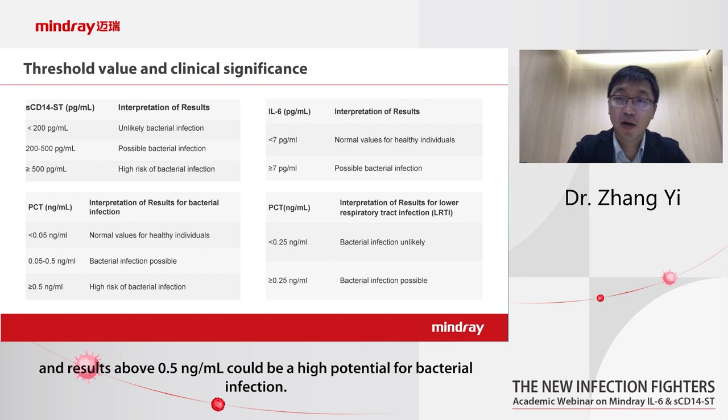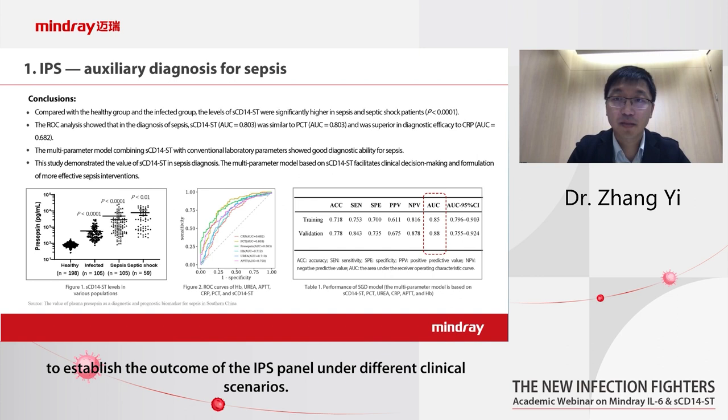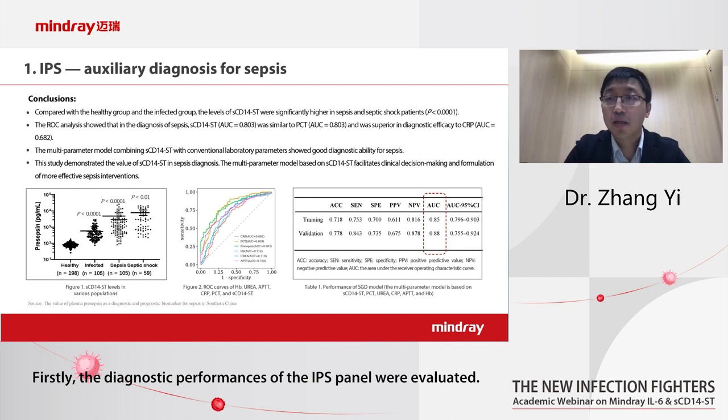Then, clinical research was carried out to establish the outcome of the IPS panel under different clinical scenarios. Firstly, the diagnostic performance of the IPS panel was evaluated.